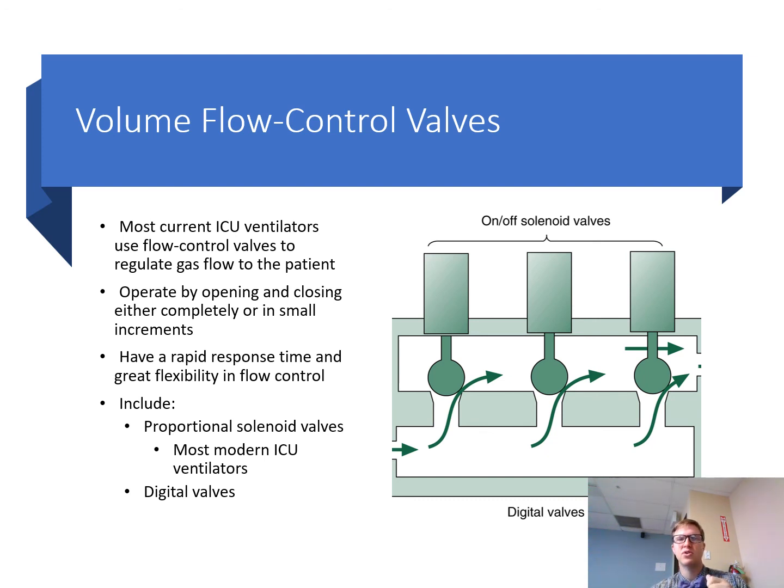So solenoids can be controlled in three ways: by electrical timers or microprocessors, by manual operation, we already talked about that. With microprocessors, that electrical current through the magnet is what opens the valves. Manual operation usually closes a switch, sending current to the magnet that would then open the valves. So pressure changes when the patient's making an inspiratory effort can cause the diaphragm to move and therefore open these valves. So it's kind of a good safety feature like we talked about before.